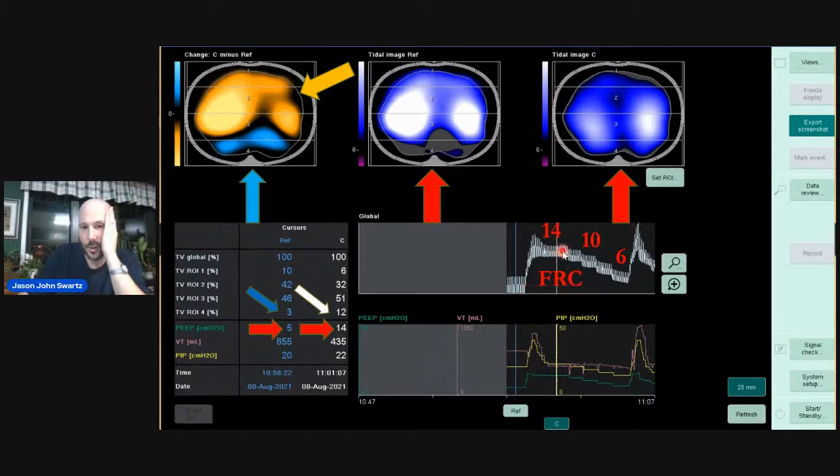So obviously you drop 14, 12, it's normal to go down, but it's not trending downwards. It's holding itself. But the minute you start going anything below 10-ish, you really see a steep decline here, meaning that if I were to reset it at 8 or anywhere below 10, I'd likely be losing all of this FRC that I had recruited, and I'm going to lose the dorsal region.